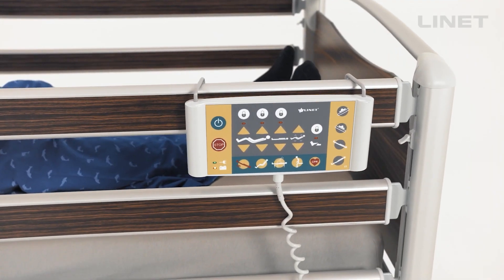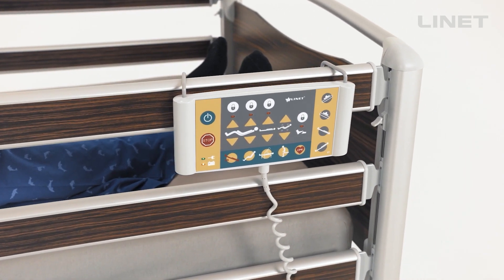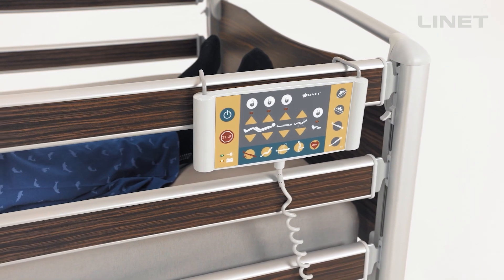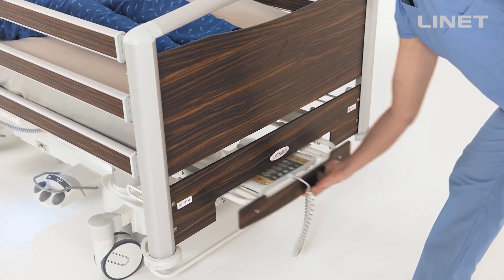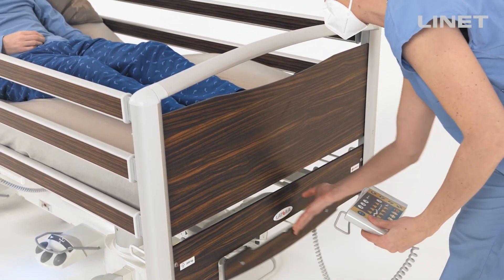The ACP, also called the Supervisor Control Panel, is the main control panel of the bed. The nurse controller can be hidden in the linen shelf or placed on the foot end.